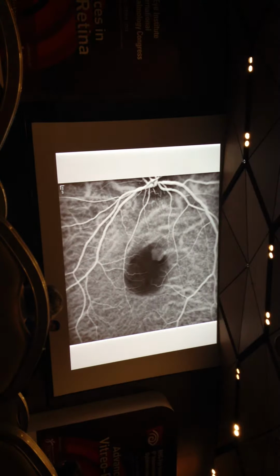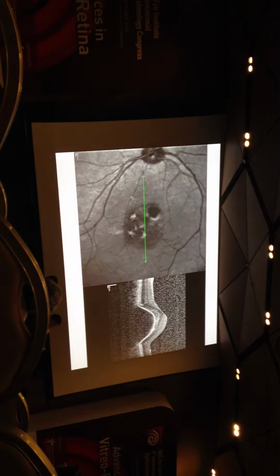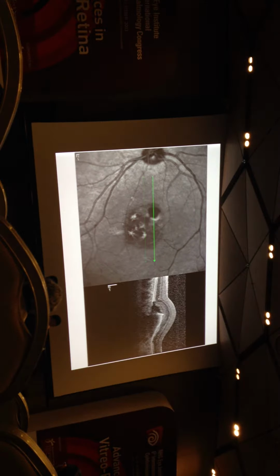I think I have the ICG. And just to give some tricks to recognize when I'm reading the ICG, you see that this is a choroidal vessel that continues over here. You see? So this is not actually a choroidal neovascularization, it's just lack of masking effect. So knowing that, and knowing the autofluorescence became black, what you can actually see in the OCT at that point is a rip of the retinal pigment epithelium.